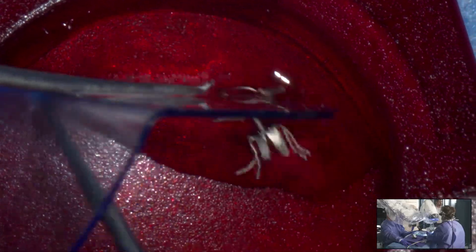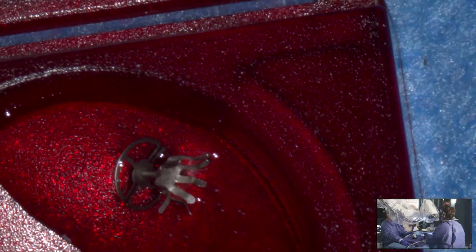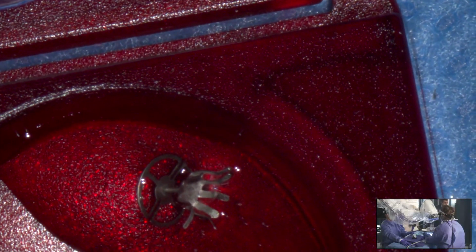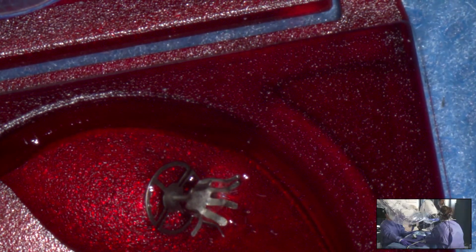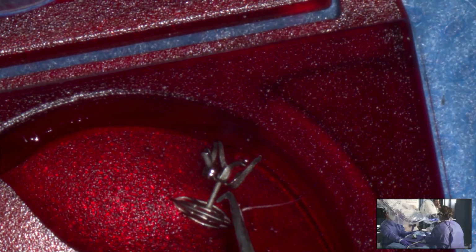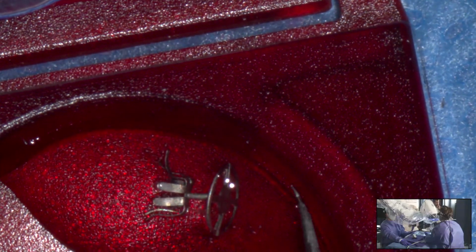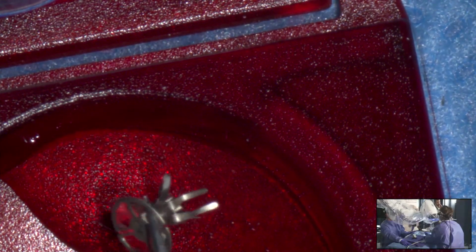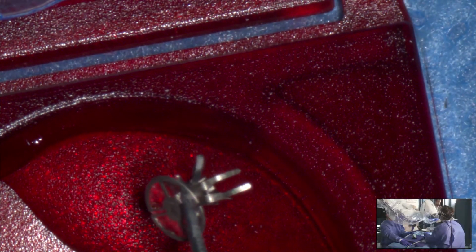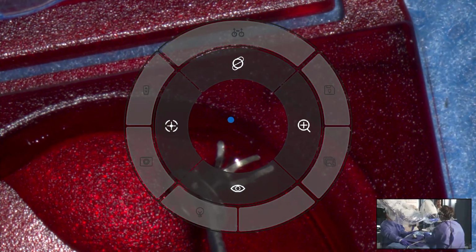Nice reddish box. Perfect view, and comfortable for me to turn my head, to turn my body a little bit, to get onto the best possible position to take out this little prosthesis here. It can be the prosthesis, or it can be a place where you prepare cartilage or fascia perichondrium, right? And then you can straight go back to the position you have previously chosen.